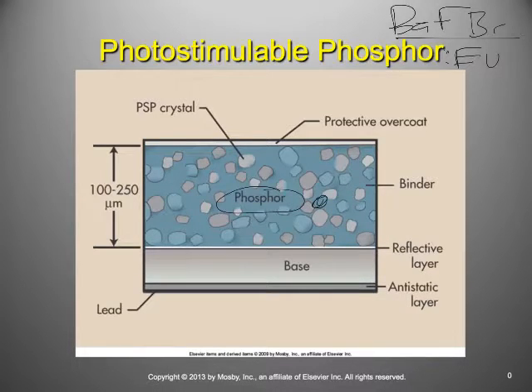If light was emitted inside this crystal, just like with a diamond ring, it can refract and go off at different angles. So the light itself might scatter slightly as it's being emitted, and we call that property turbid or turbidity. It's not a good thing. We don't want that.